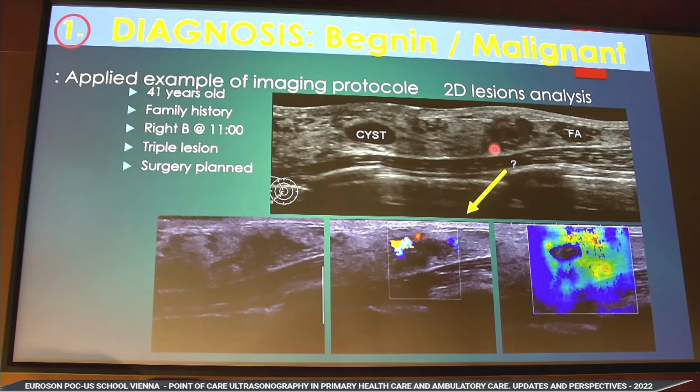But following this lady, a specific zone appears between the two benign lesions. How can I analyze that? I focus with a special probe on this area: hypoechogenic, spiculated, duct involvement, plus real vascularization with Doppler. High vascularization. And here the elastography, which gives you information that you have modification of the elasticity of the tumor itself and the surrounding tissue.